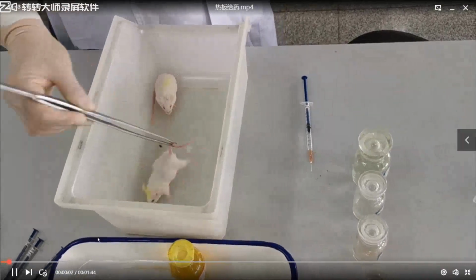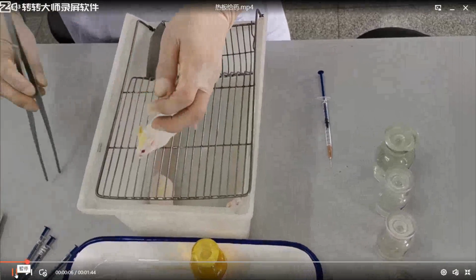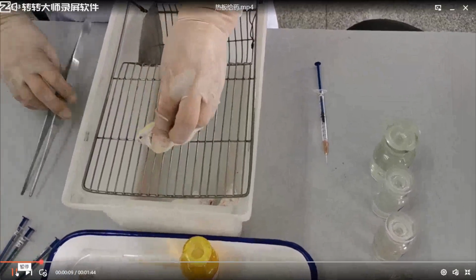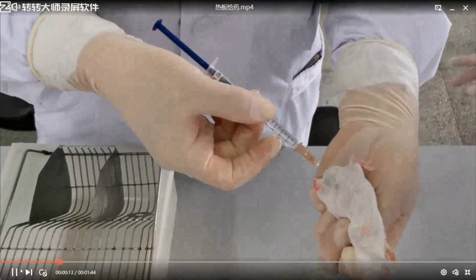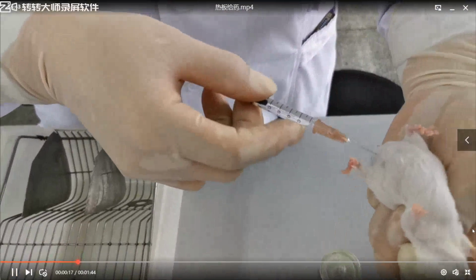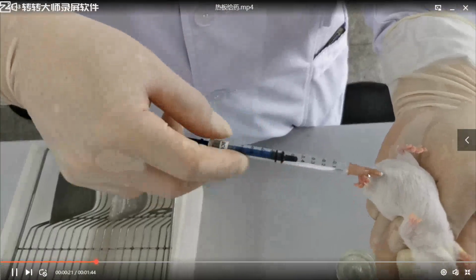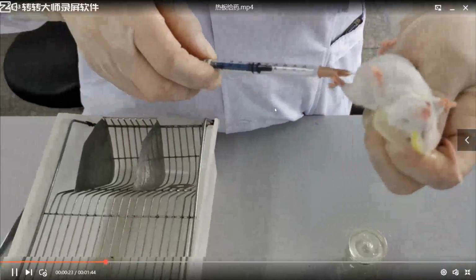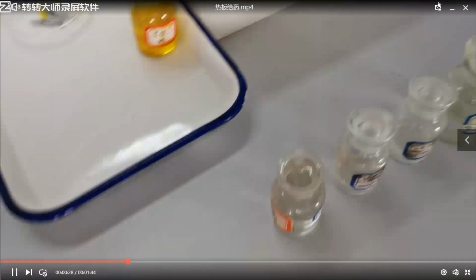The first mouse, we will inject normal saline as the negative control group. You can use one hand or two hands to restrain the mouse. Intraperitoneal injection. Do you remember the method of intraperitoneal injection? Lower abdominal cavity near the middle line, and then inject the drugs intraperitoneally.